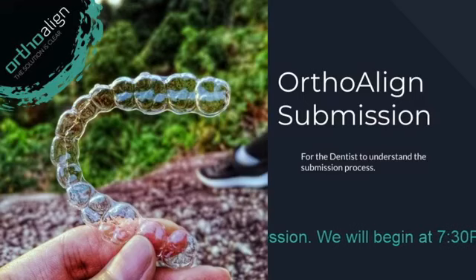It's also very important that you do some sort of scaling before you send the intraoral scans to us. Same as when you take a traditional impression, you want to make sure that you remove any buildup of plaque, or for example any calculus on the teeth. You want to get rid of all of those, so that when you submit to us, we can see the gingival margin of the teeth very clearly. So this is definitely going to be very important. And those are some of the tips for taking the intraoral scans.